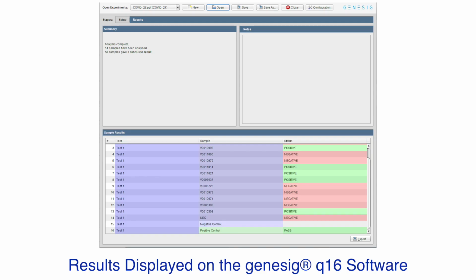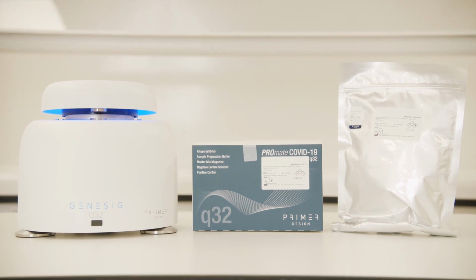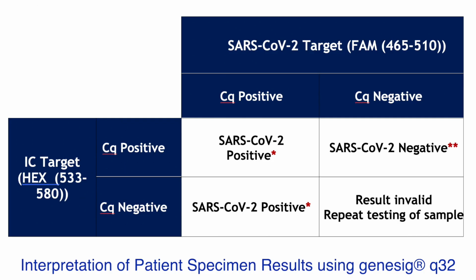For the Q16, the cycling conditions are preloaded into the software. If the run pass criteria are satisfied, then the patient samples are interpreted by the Q16 as negative or positive. For the Q32, the cycling conditions are provided in the supplied template run file. If the run pass criteria are satisfied, then the patient samples can be interpreted with the following table found in the IFU.